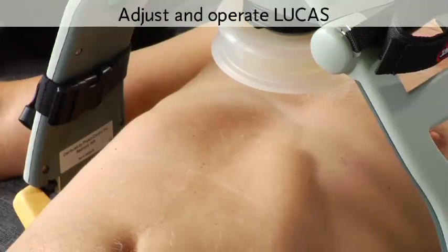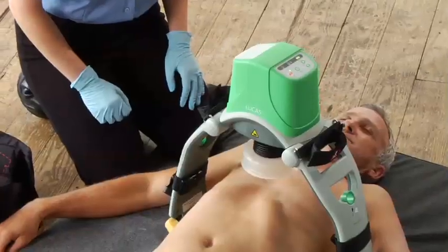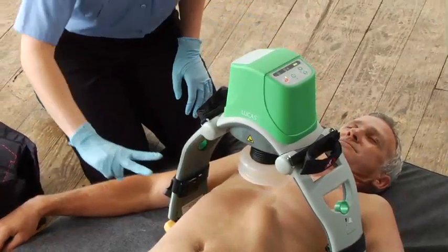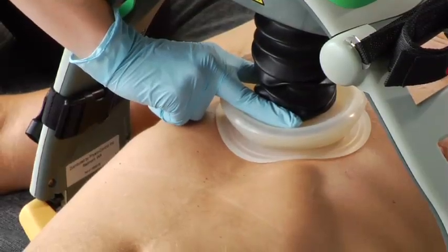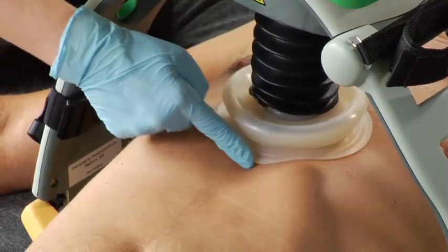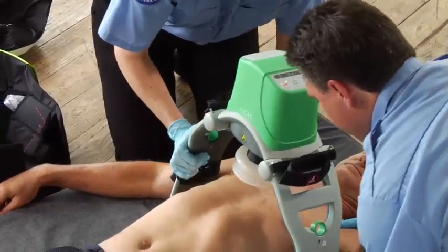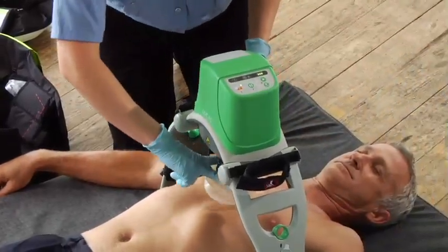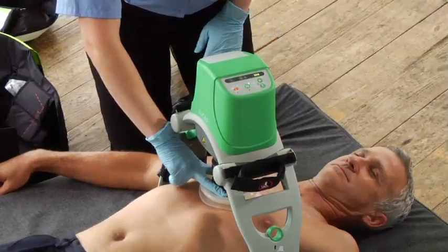It's important to position the suction cup correctly for effective compressions and to avoid serious patient injury or compromising circulation. Center it on the sternum with the lower edge of the cup just above the end of the sternum. You should be in adjust mode — you can tell by the LED. Use two fingers to lower the suction cup so the pressure pad inside the cup touches the patient's chest without compressing it. If the edge of the cup is below the sternum edge, reposition the cup by lifting it and moving Lucas by pulling on the support legs. Hold it in place and push the pause button to set the upper limit of compression. Press pause before removing your hand from the suction cup.